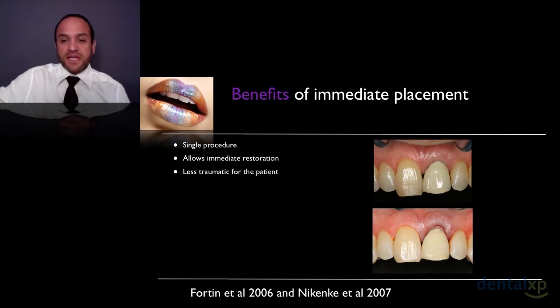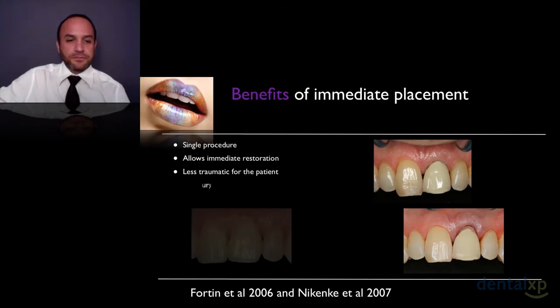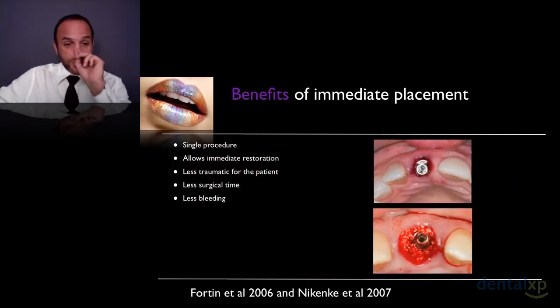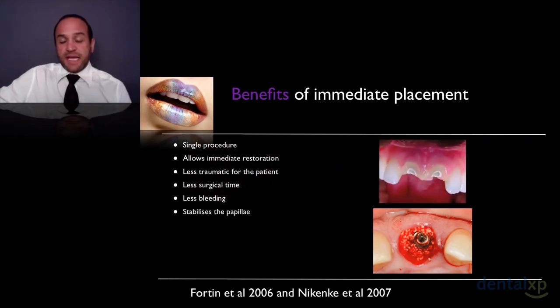And here you can see again, by undermining the underlying part of the crown to create a concavity there, we actually managed to take the gingival level from there and bring it down by making a concave underneath the crown. So there's far less surgical time in these cases. There's far less bleeding because we're stabilizing the soft tissues and the clots. And also we're stabilizing the papilla, more importantly, in multiple situations. And here you can see a case where we didn't have primary stability for immediate provisionalization. So what we did is we customized our abutments, and the customization of our abutments allowed the papillae to stay in place, because essentially the gum doesn't know whether there's an implant or a tooth or a custom abutment there.